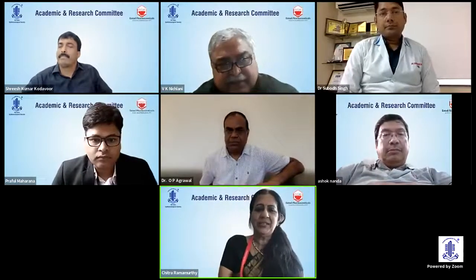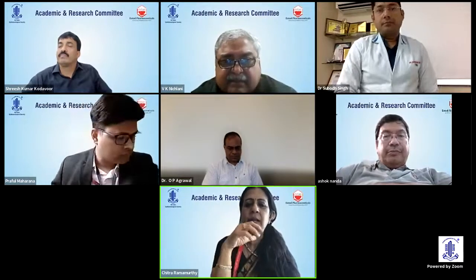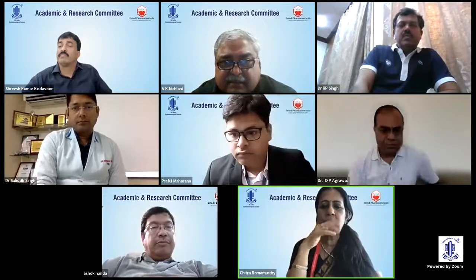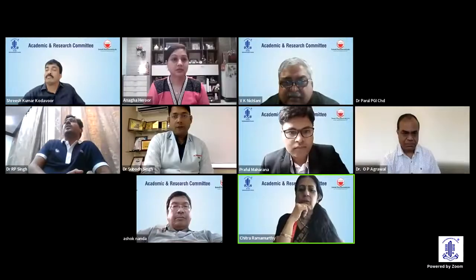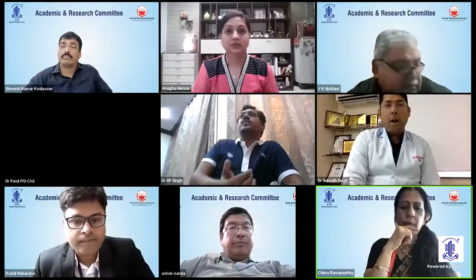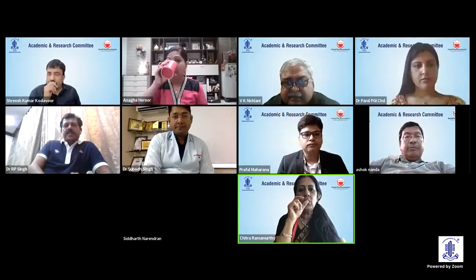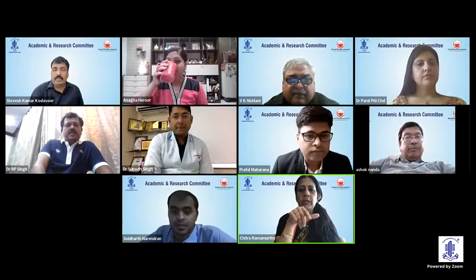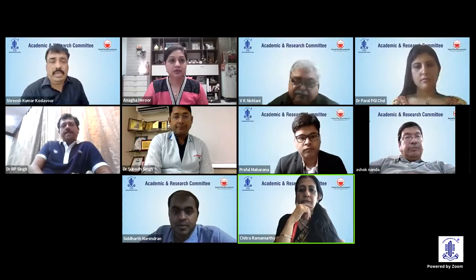Thank you very much, Dr. Nichlani. That was a challenging case which you showed. Of course, I would have preferred to have removed it with phaco if I had put an IOL scaffold. Shrish, I'm going to ask you one question. What inflammatory control would you work out for these patients preoperatively before we pick them up for surgery?